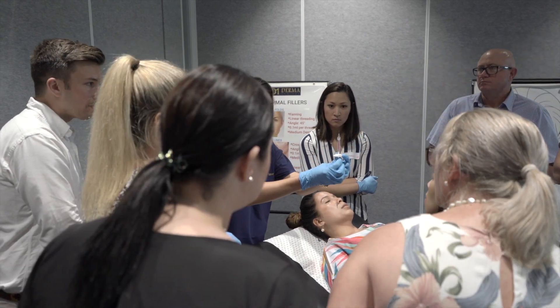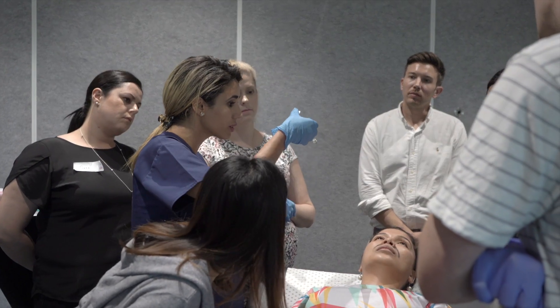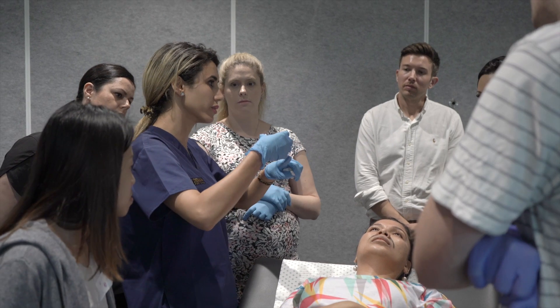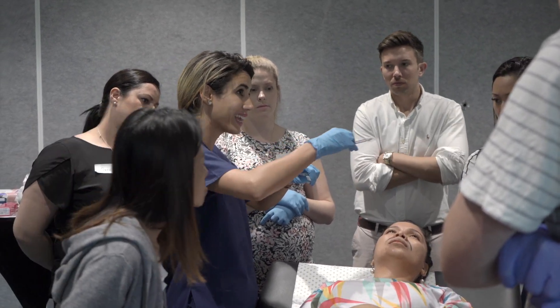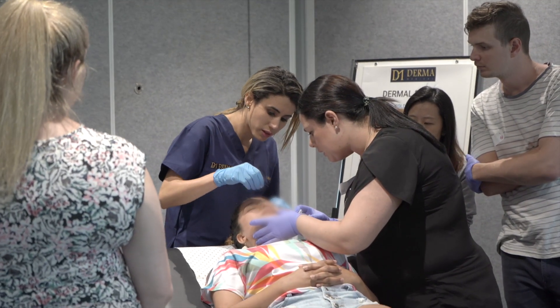So that wraps up the foundation course on dermal filler here in Brisbane. The students started out a little bit nervous. The problem is if you keep going down, you're going to hit an artery or something, so you don't want to do that — you want to just turn a needle and drop it down, maintain that needle into the dermis, and then do your retrograde. As we went on doing the anti-wrinkle and fillers, they were really scared about the lip fillers, but they've done an awesome job.